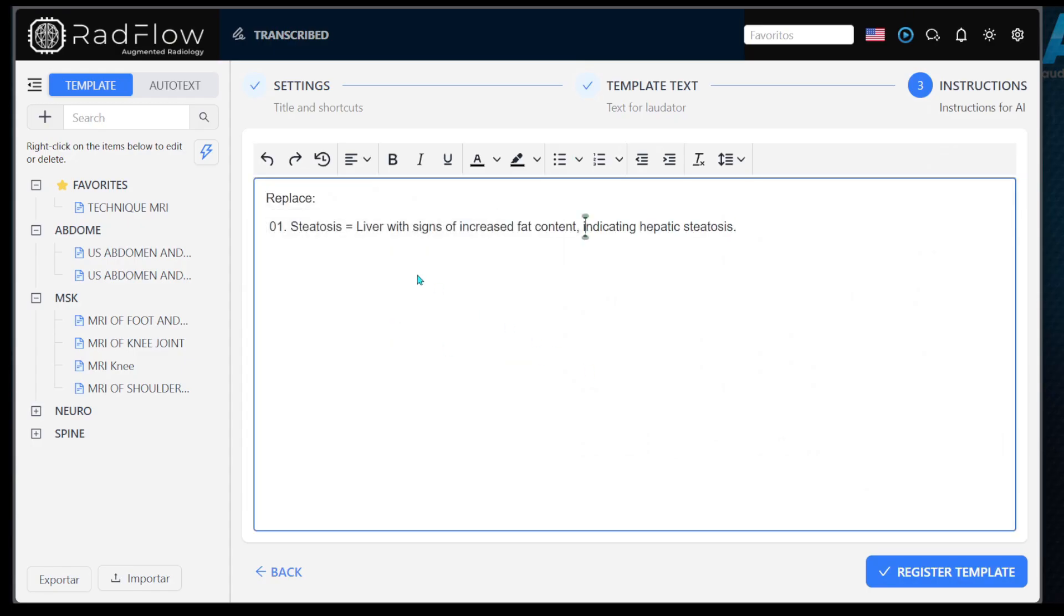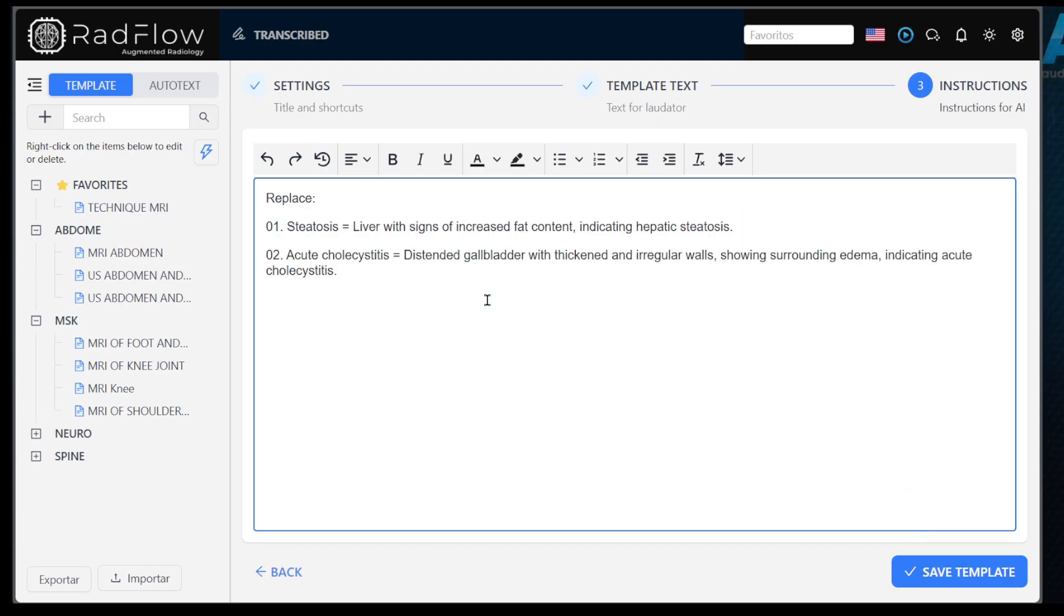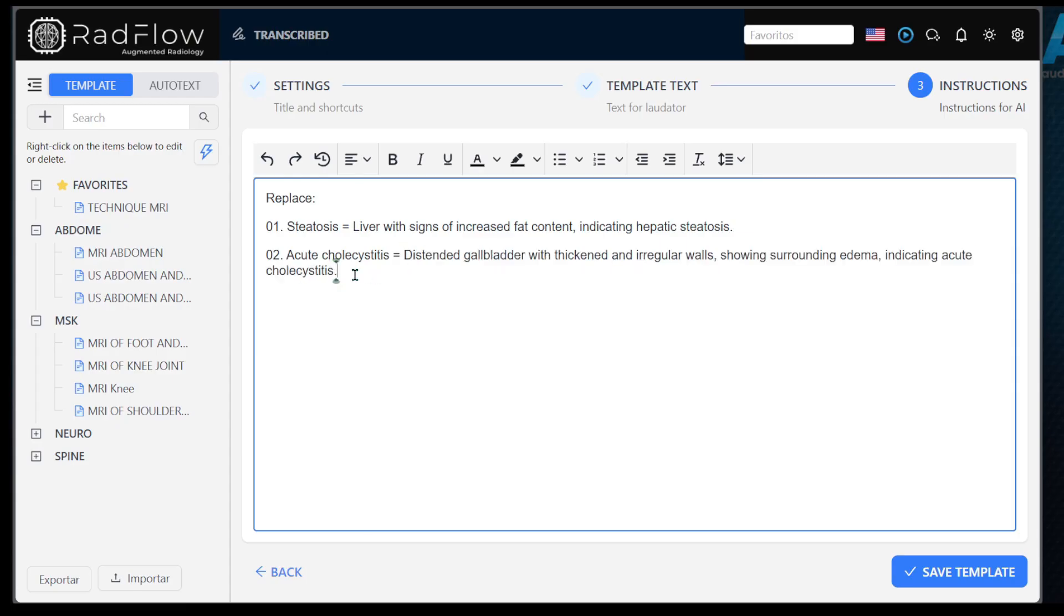For example, replace steatosis with liver with signs of increased fat content indicating hepatic steatosis. And acute cholecystitis, distended gallbladder with thickened and irregular walls, showing surrounding edema, indicating acute cholecystitis. This way, the model will replace the keywords with the phrases you choose.